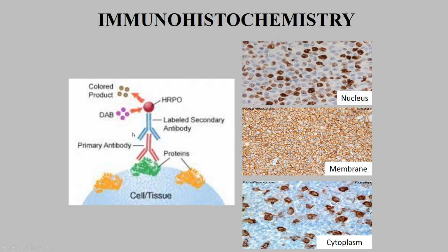In the case when the reaction is not done, all colored product is washed away.